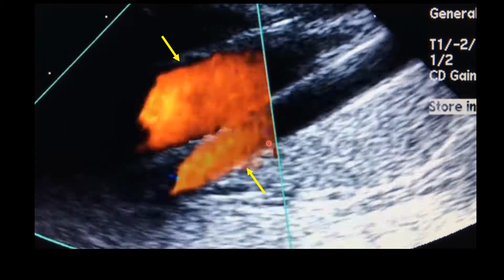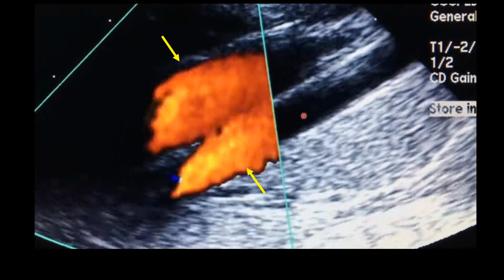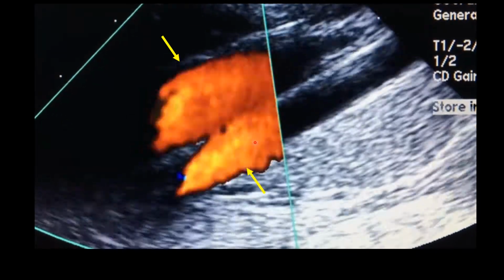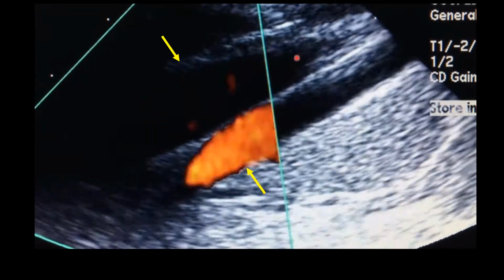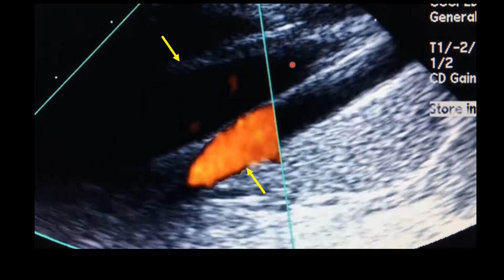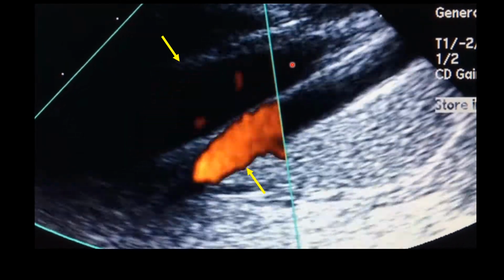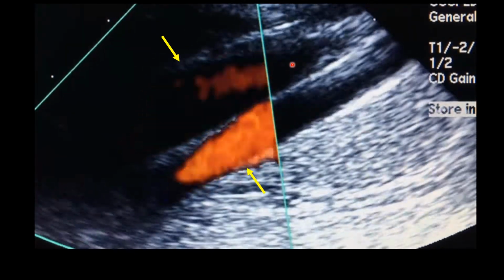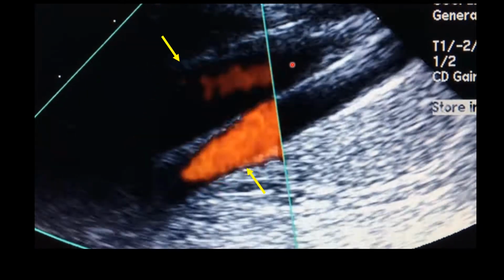So let's ask ourselves, can we see a pulse? Yes, I can see a single pulse. Is there any flow reversal? No flow reversal here, where there's certainly flow reversal here. So all of this blood has to go to the brain, and we're going to see the echo in a minute to explain how this works. But let's do some detective work. A fluid is non-compressible. It has to come from somewhere, and it has to go somewhere.